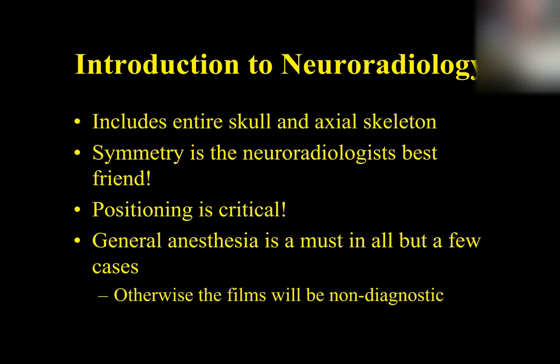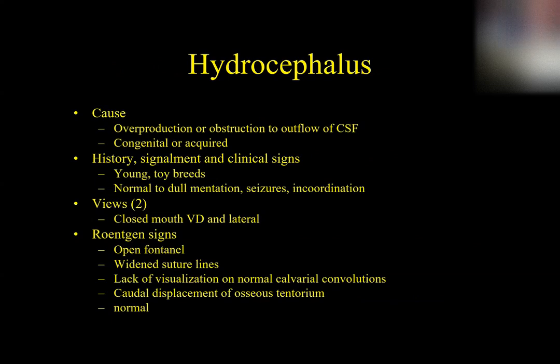Sometimes if you're shooting thoracic films or abdominal films, it may not be needed. But neuro stuff, because positioning is so critical, for the most part, general anesthesia is going to be needed. Okay, so that's kind of my intro into neuroradiology.